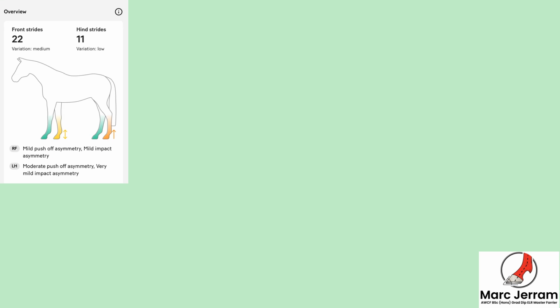So, one thing I'd like to bring to your attention is I do tend to use this a lot in conjunction with other systems, and I think this is where the main strength of a Sleip system really is, from a Farriery perspective as well, because the more evidence we have, the more data we have, the more we've got to back up our protocols, and the more we can also protect ourselves a little bit in terms of the justifications we choose.